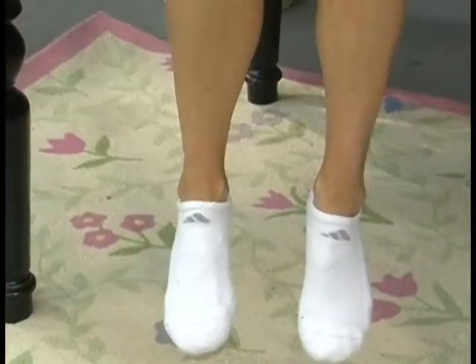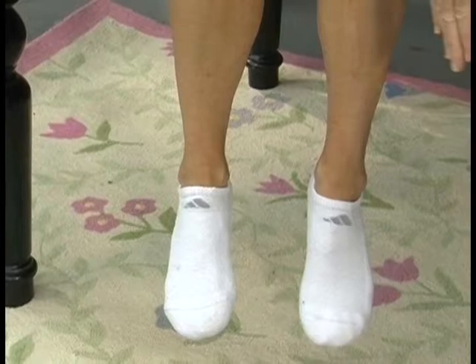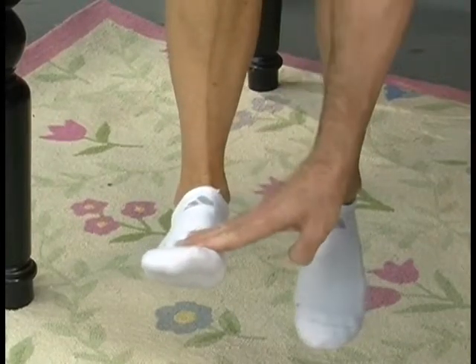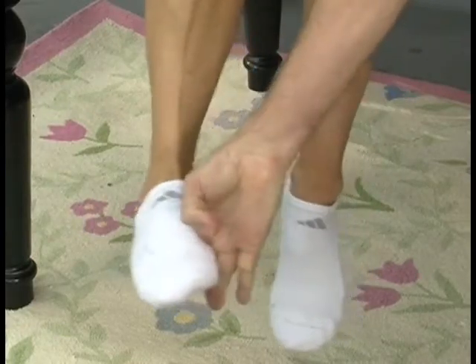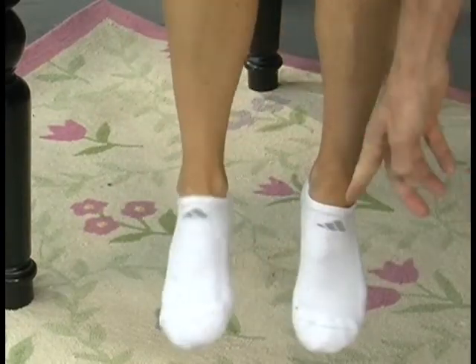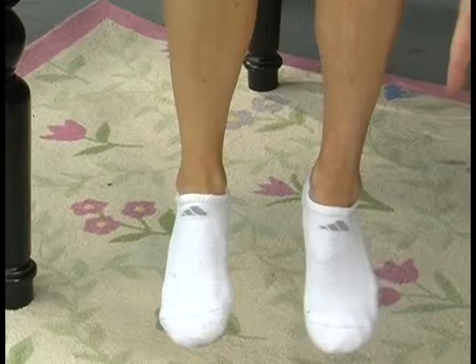What I'd like to do is demonstrate some of the factors we had to deal with with Beth as we're trying to help her brace to have a normal running gait. First thing I want you to do, Beth, is bring your right foot up into dorsiflexion for me — don't let me push it down. Show how strong that is. Turn it out this way for me, don't let me push it in. Turn it in this way for me, don't let me push it out.